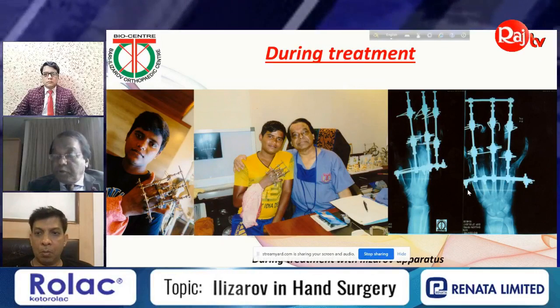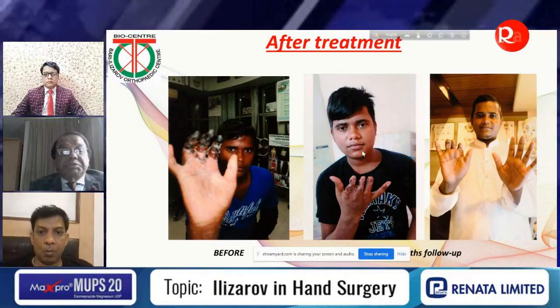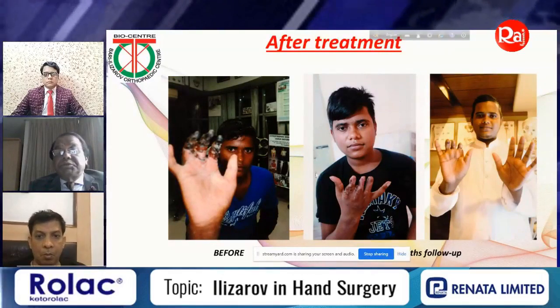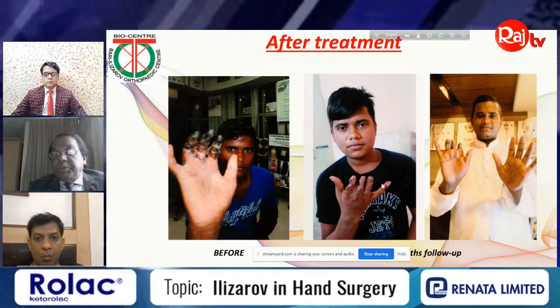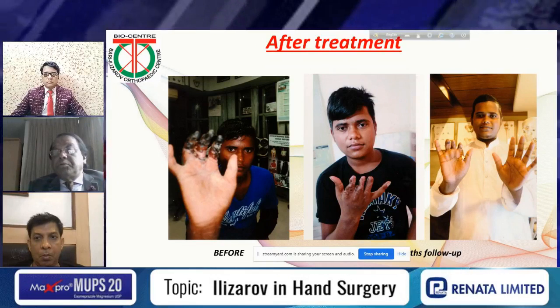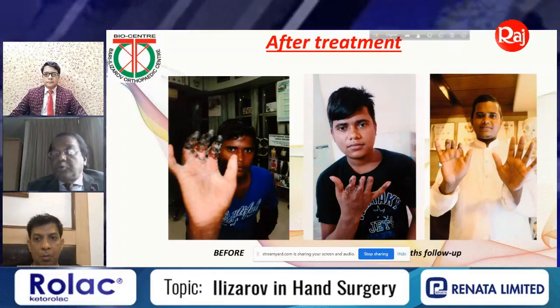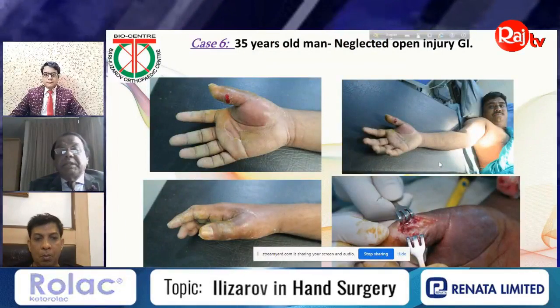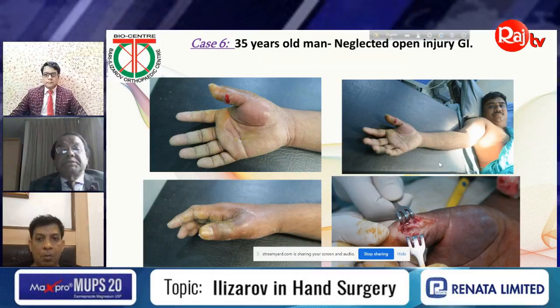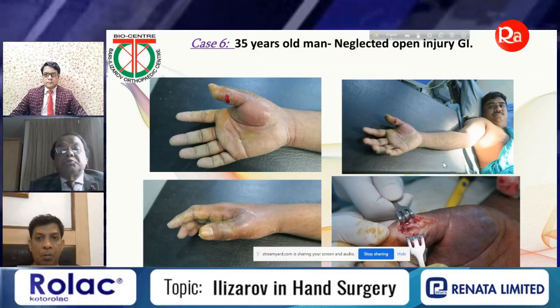Gradually I have followed the case, and then what happened, see from this situation to that situation. Patient is happy. This is the follow-up. You can see here, this is okay, but I suggested him to go for lengthening, and then he came to my place, and later on he told me that he will come again and I'll do the lengthening.